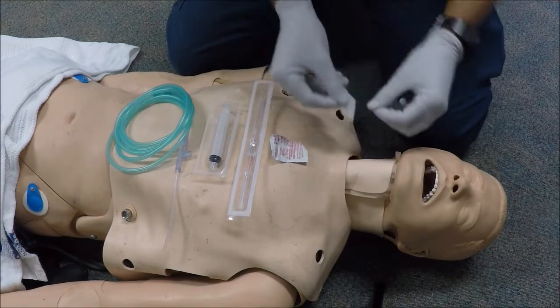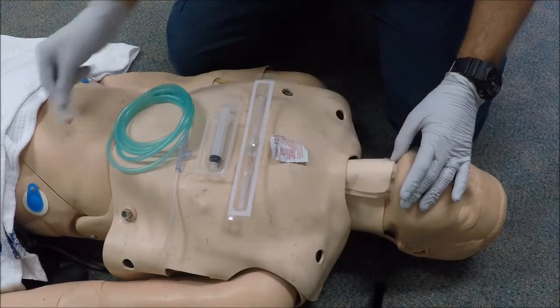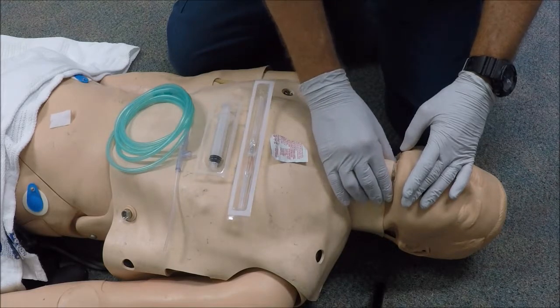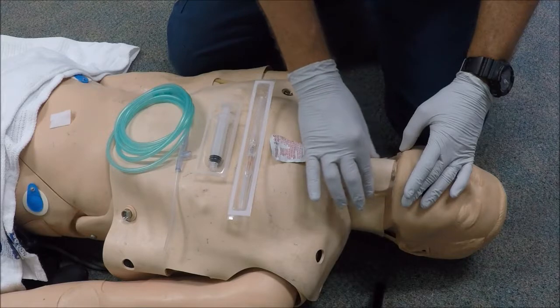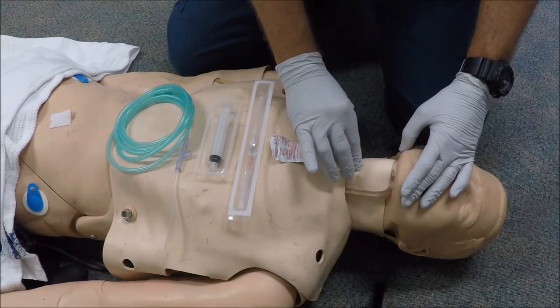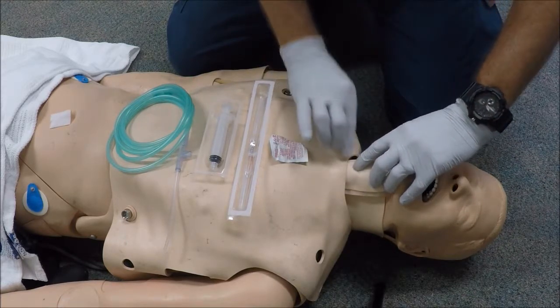So the procedure would be as follows: swab the area to maintain aseptic technique. Use our landmarks again, finding the hyoid bone, the thyroid cartilage and the cricoid cartilage, locating your cricothyroid membrane.